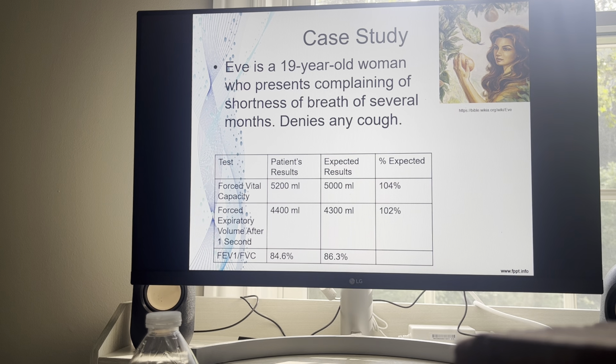So this spirometer provides the results in milliliters, most use liters, but that's okay, we can deal with that. We don't have a flow loop to evaluate. So let's go to the next step. Is her FEV1 FVC ratio less than 70%? No, it's not. She's at nearly 85%. So she does not have obstructive lung disease.